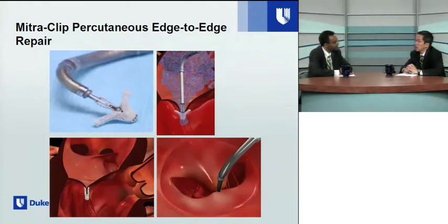It's hard to know, and I am skeptical that an intracardiac echo probe would allow us to see the degree of the left atrium that we would need to see, especially from the right atrial side. Or importantly, as we go across the mitral valve, really from the ventricular side, what the clip looks like.